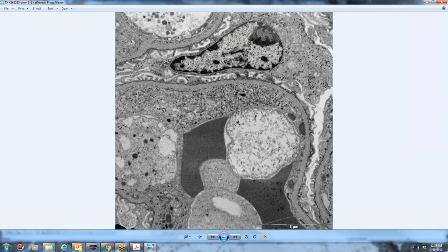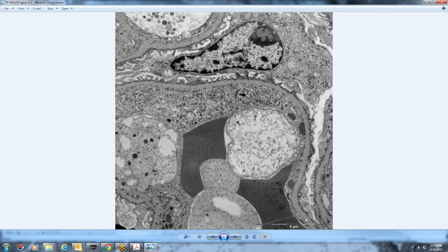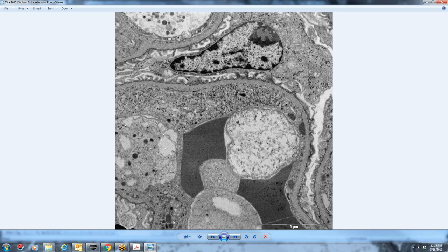And the EM was very interesting in this case. A lot of the capillary loops in this particular case were of normal thickness. I'm following along the glomerular basement membrane. We still have some pretty viable podocytes out here with good foot processes, and all of this would be inside a capillary lumen.